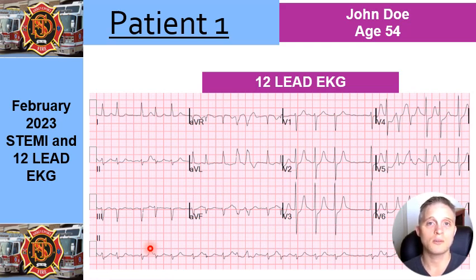But in order to count the rate, you have two options. One, you can look at the monitor, which isn't always right. Sometimes the monitor can tell you that a patient in normal sinus can be in supraventricular tachycardia because the equipment and the software are overcounting. So instead, you need to count by yourself. If it looks fast, it is fast. That's a good way of determining.